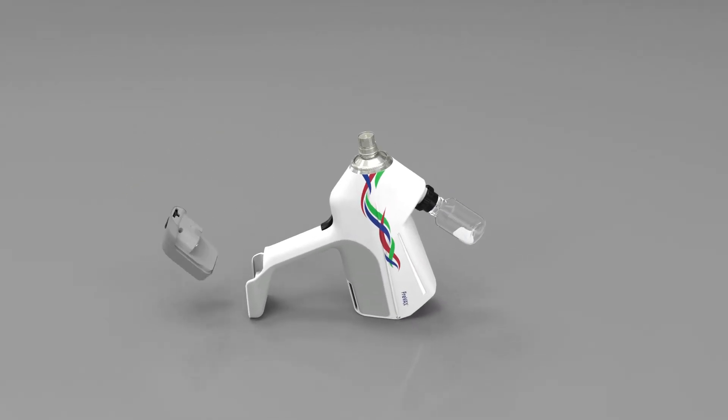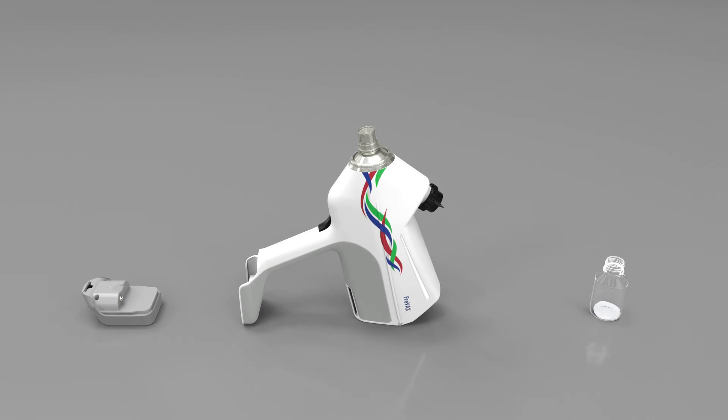Once finished, remove the PET bottle and, without further activation of the trigger, remove the battery from the device to turn it off.